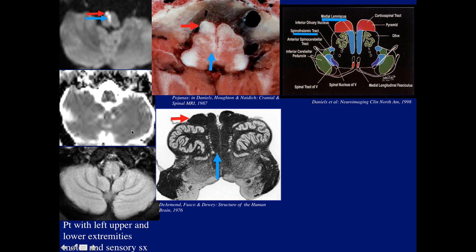Here we have a stroke. The patient presented with upper left upper and lower extremity sensory symptoms. We can see the patient had both motor and sensory symptoms. The pyramid is the corticospinal tract and this is the medial lemniscus — sensory. So the stroke is involving the corticospinal tract and the medial lemniscus, explaining why the patient has both upper and lower extremity motor and sensory symptoms.